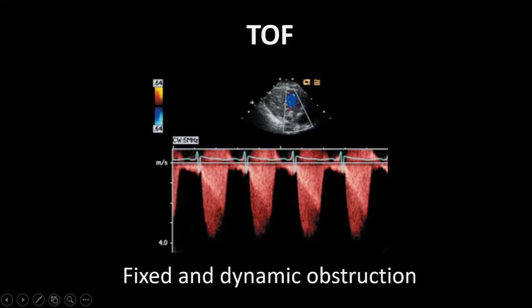As the ventricle contracts, it continues to narrow the outflow tract, and that's why the obstruction becomes most severe toward the end of systole. The fixed obstruction has this envelope here and has this earlier peak here versus here. You can see the same thing on the left side too when you have both fixed and dynamic obstruction.